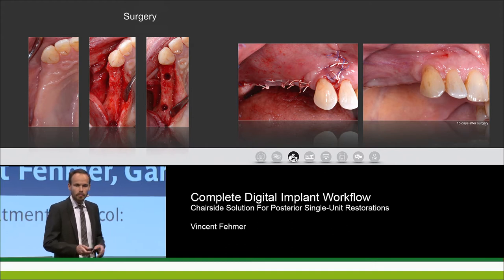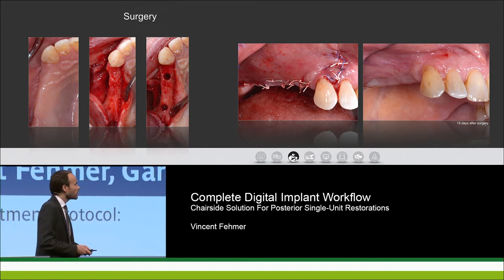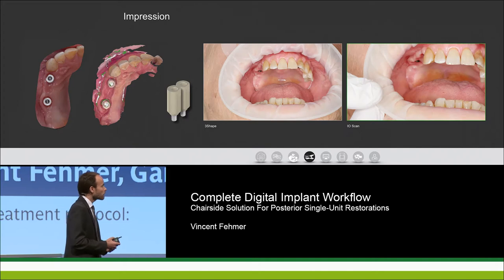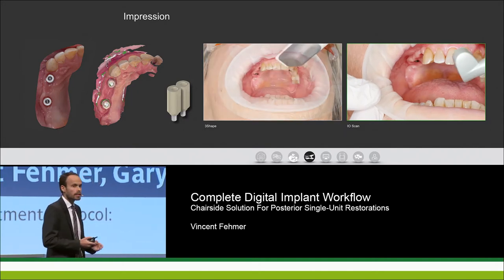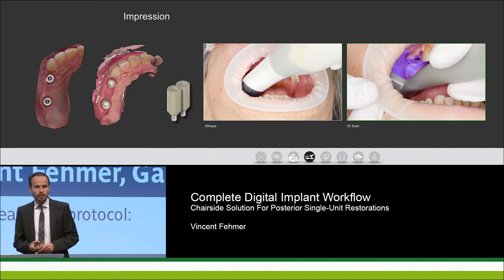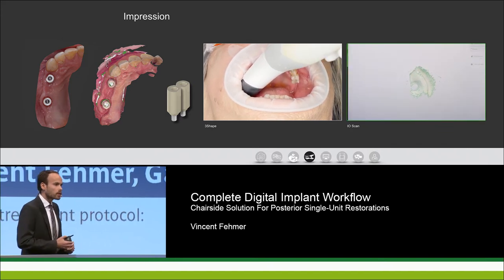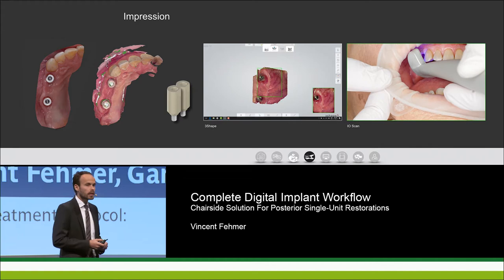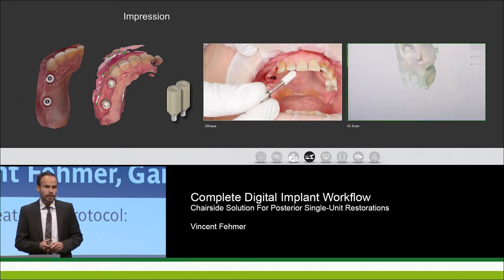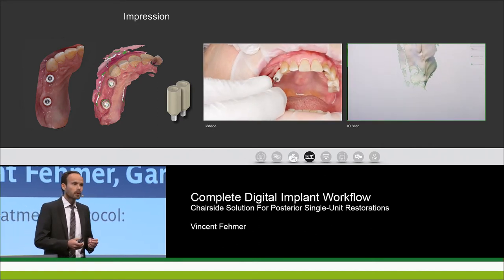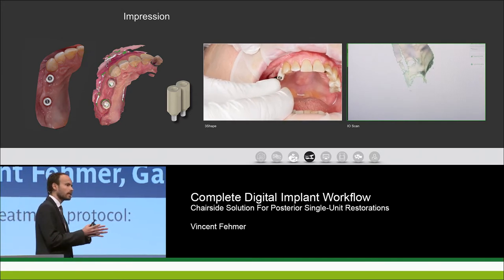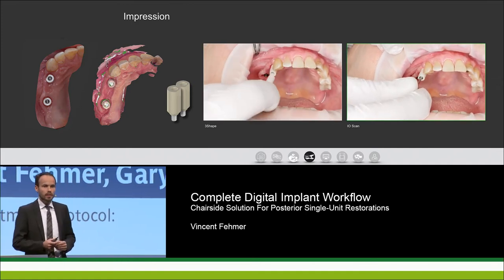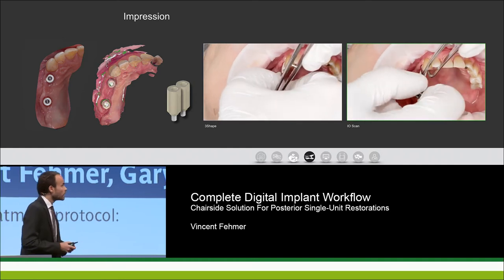The patient was very happy and didn't undergo any stress. We then opened up the abutments and had the chance to utilize this new approach: starting with the optical impression. Very important at this point is to understand the link from the mono scan body — the scan body you see here in the center of the picture — through the design software of the dental laboratory.